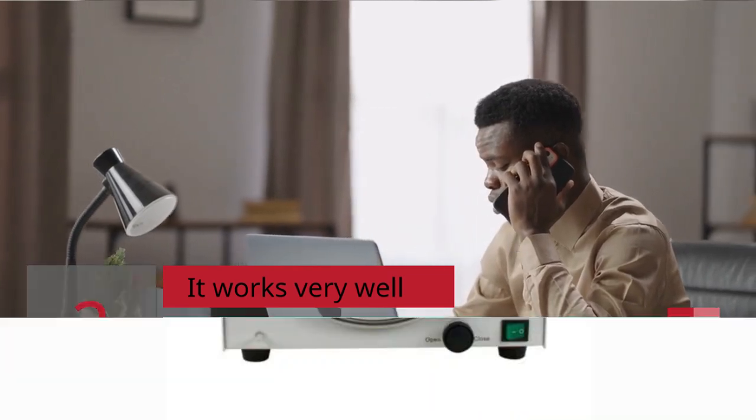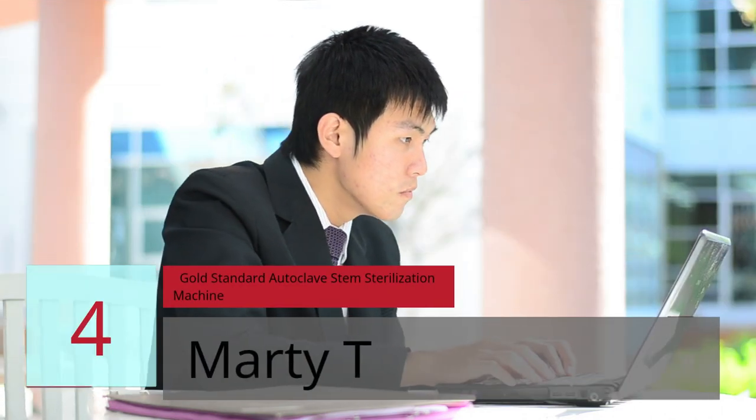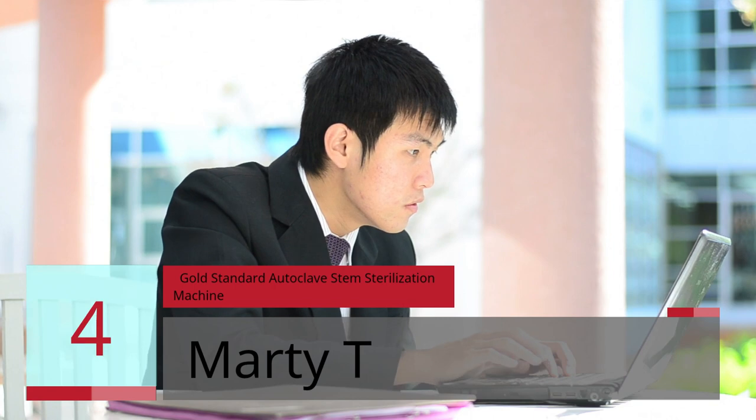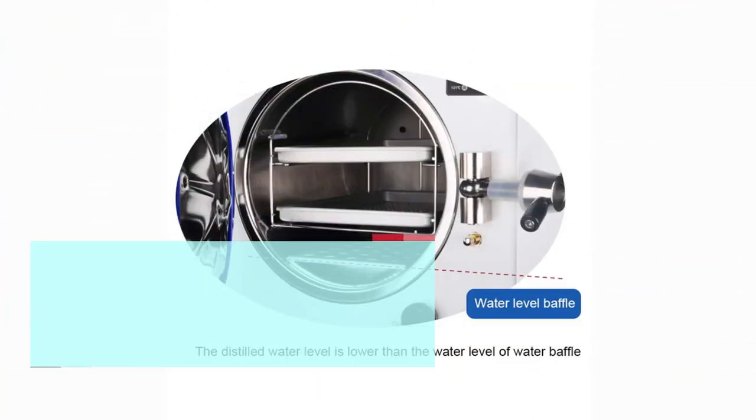Three star. The machine presents me with an error on the screen that says Error E1. What should I do? — Amazon customer. Number four: 'Gold standard autoclave stem sterilization machine' — Marty T, five star.